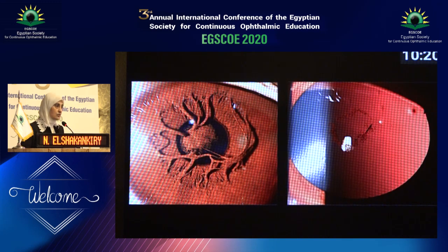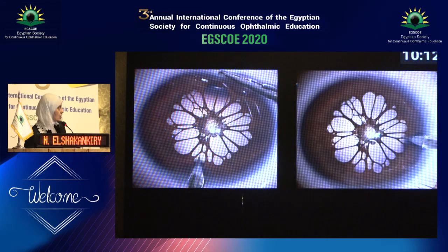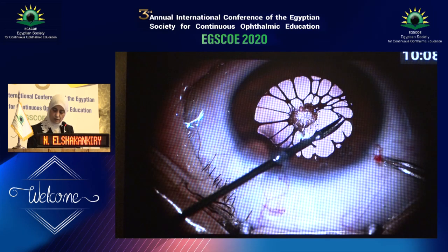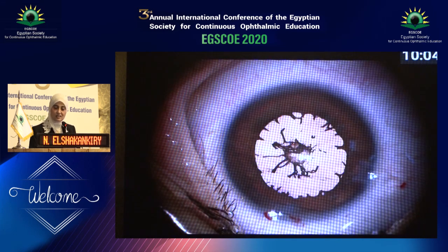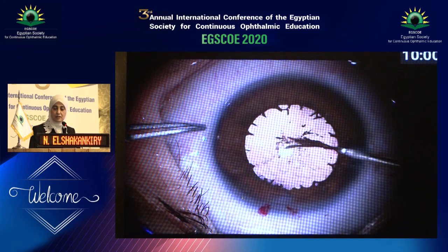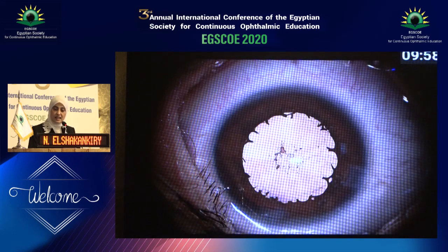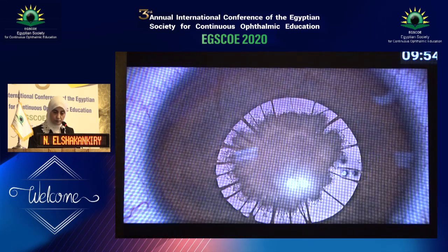Surgery is very simple. It's just peeling off the membrane off the surface. During surgery, 2 wounds are opened with an MVR knife like that, 20 gauge, and then with the micro scissors, we cut the strands 360 degrees, and then the adherent part is peeled off the anterior surface of the lens with a special forceps, and here is the conclusion of surgery. Finally we close the wounds.